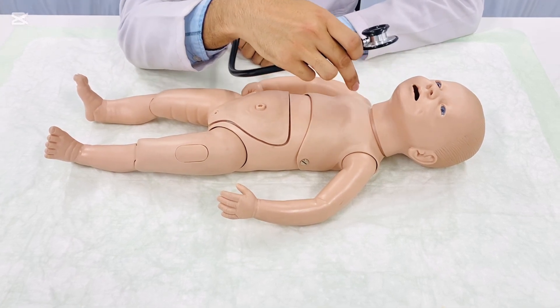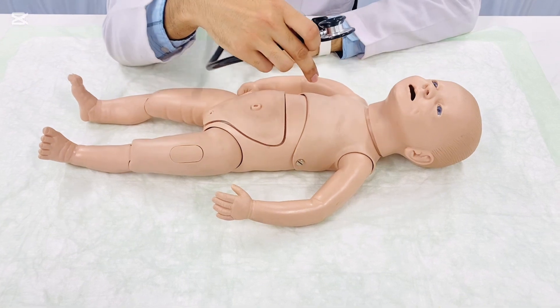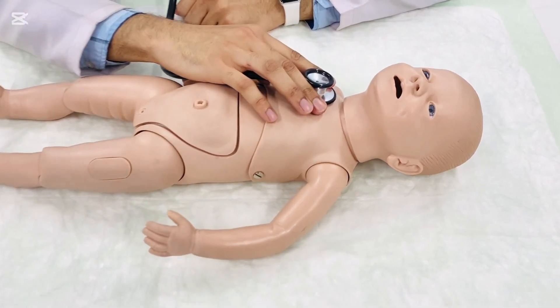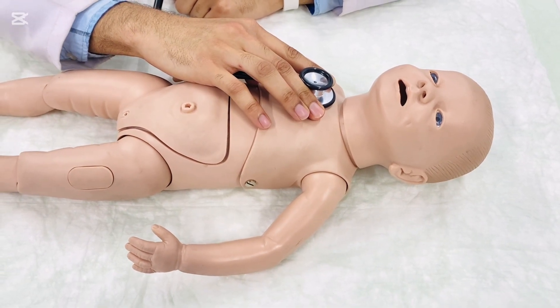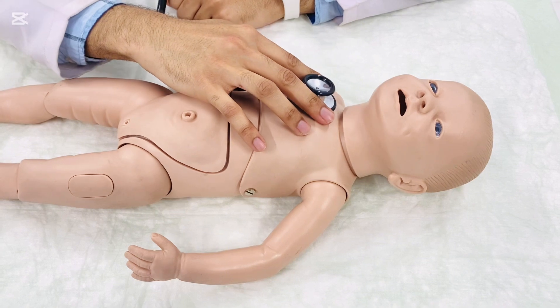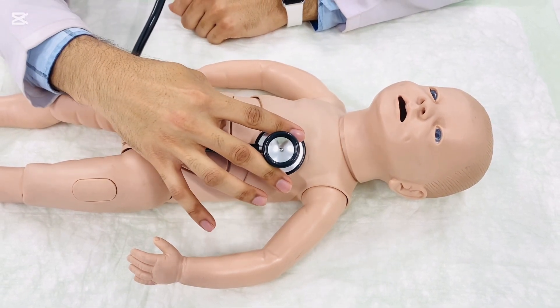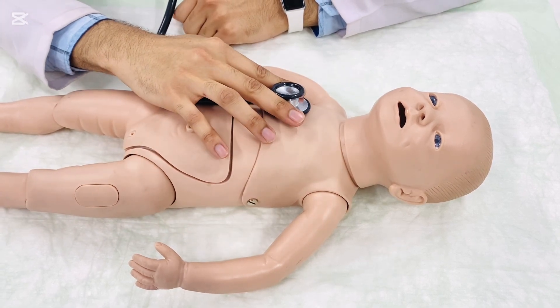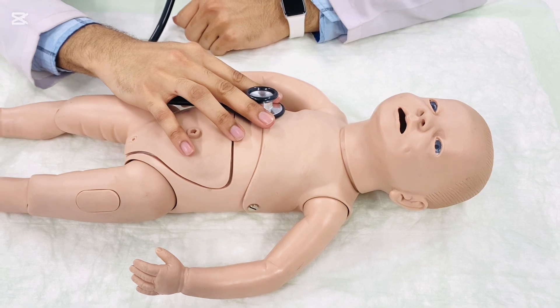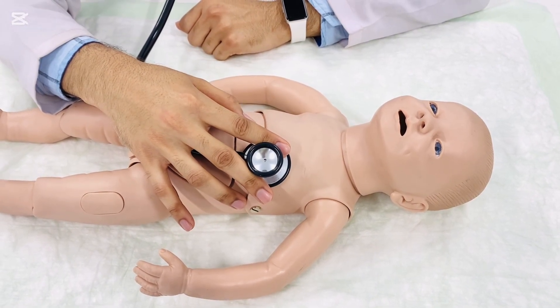The asymmetrical pattern goes: first the infraclavicular, next the mid chest, then the lower — that is asymmetrical. Now we auscultate the lungs in symmetrical fashion: first the right infraclavicular, then the left infraclavicular region, then the mid chest on both sides, and then the base of the lungs on both sides.